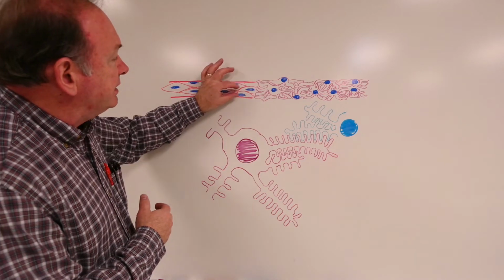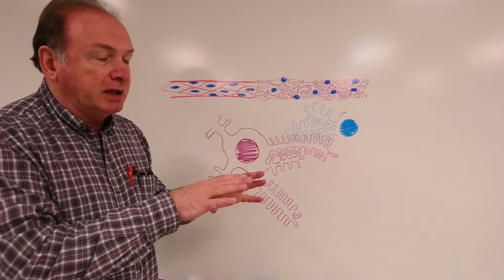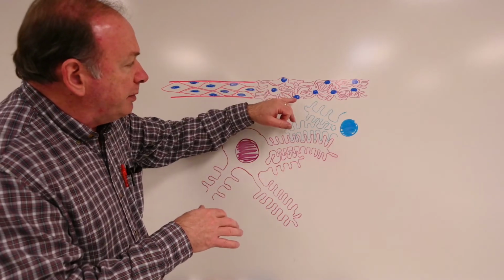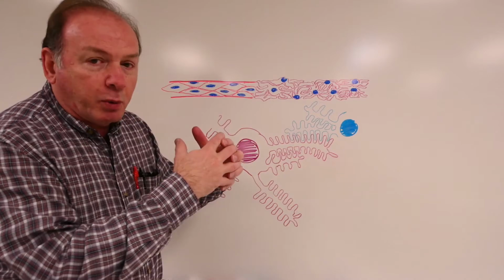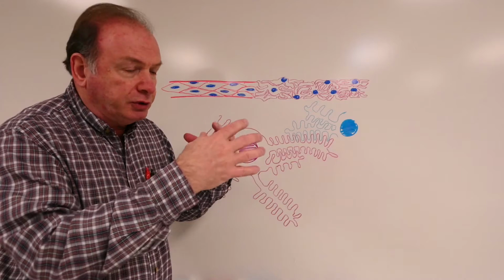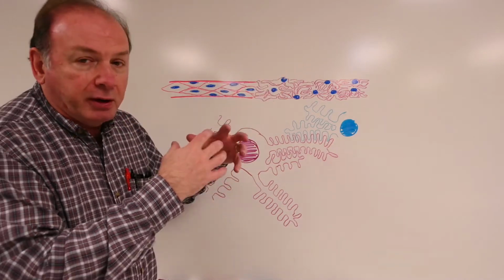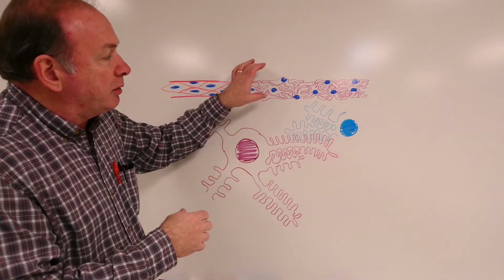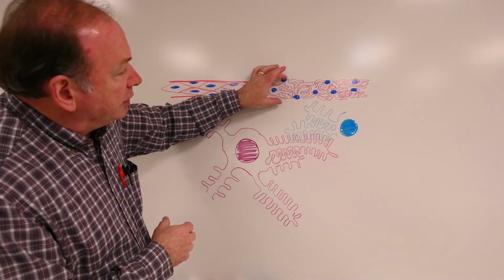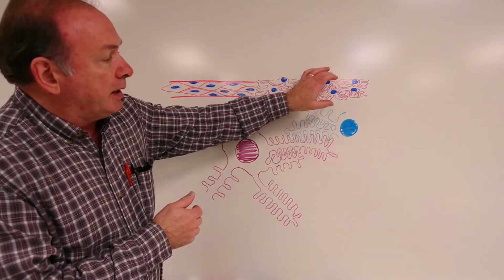But on the outside of these cells, you find those podocytes. The podocytes have foot processes. That's where we get the name podocyte. So we have all these extensions that come out from the cells that interdigitate with one another, interlock with one another. Looks like tentacles from an octopus, different octopi coming together, or like lots of spiders around the outside where their legs all interlock with one another on the outside of these capillaries. So that kind of gives a view there. We'll also see a view from the textbook of what that looks like, where they interlock.